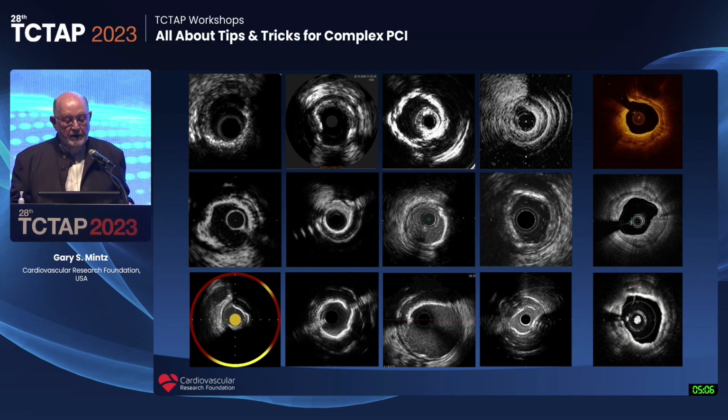Going to intravascular imaging, because that is the alternative, the advantage of intravascular imaging is in individual patients, not so much in populations. These are 12 IVUS studies and 3 OCT studies showing that the imaging appearance of calcium is remarkably similar regardless of the machine, going back way to the early 1990s and even most recently with high definition IVUS.